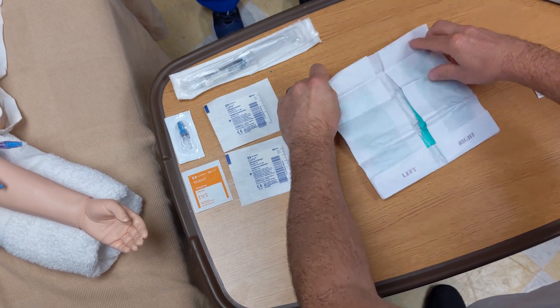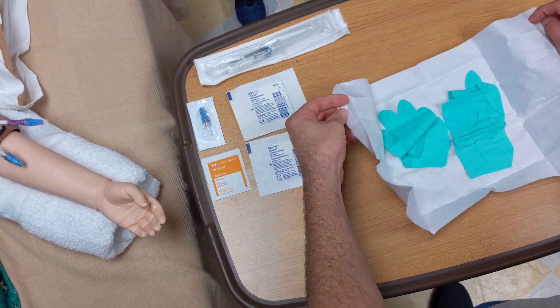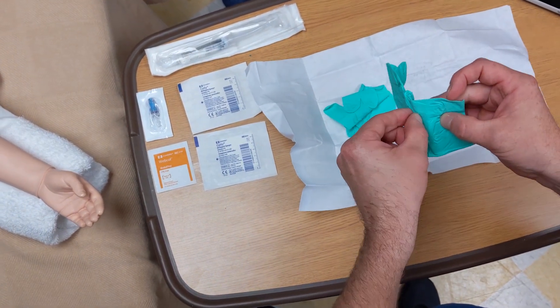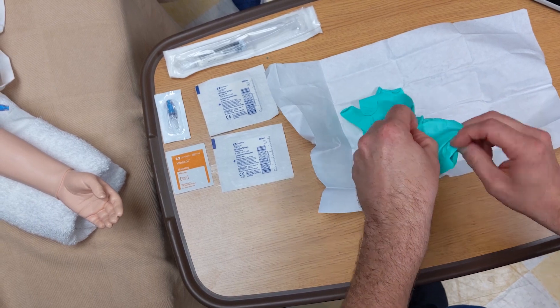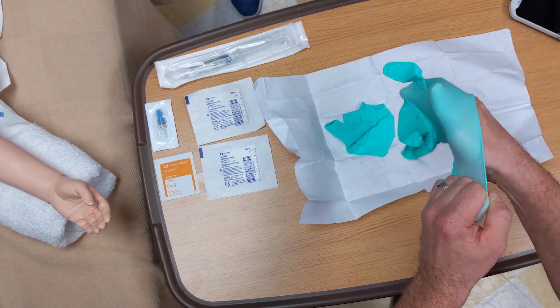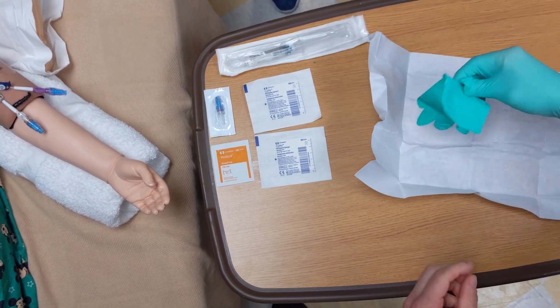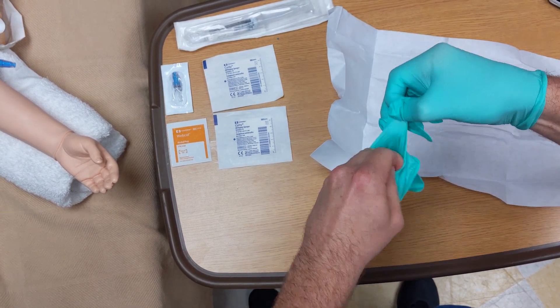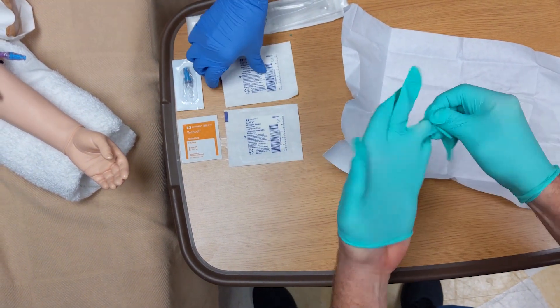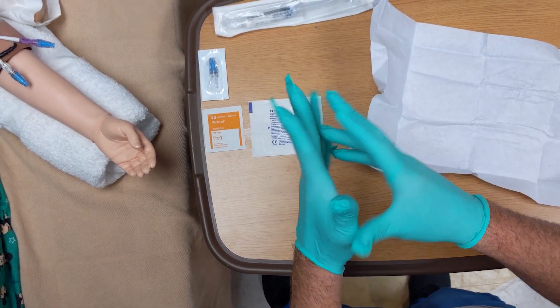Open the package without touching any side. You can grab the gloves by the part that's folded over — the cuff of the glove. It's okay to touch the parts that are going to be on the inside of the glove, touching your hand. They can be difficult to get on, but once you have one sterile glove on, you can touch the other sterile glove anywhere as long as you don't touch yourself. Once you have both gloves on, use both hands to fix the fingers and get them situated so that you can be very agile with your movements.